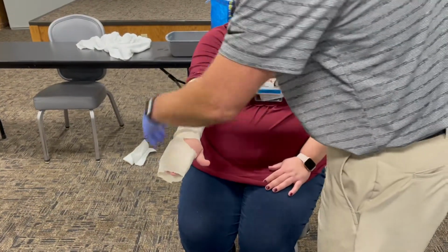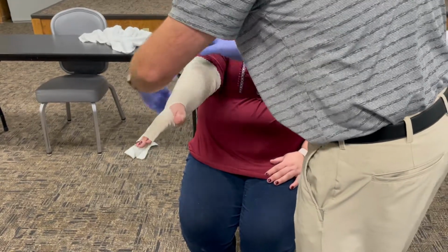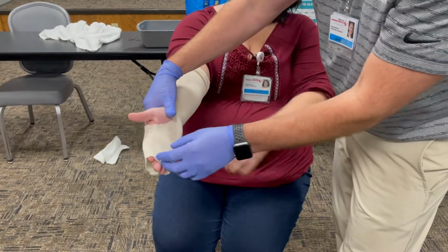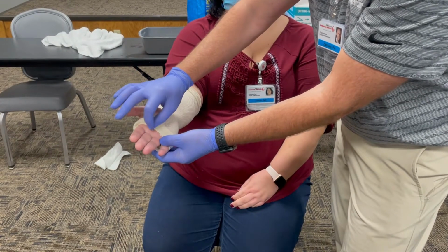Yep, that's good. We'll go past the elbow a little bit. That looks good. Okay. And remember with your volar splints, you're actually only coming to about the crease on the metacarpal phalangeal joint. So you can even fold that down a little bit.